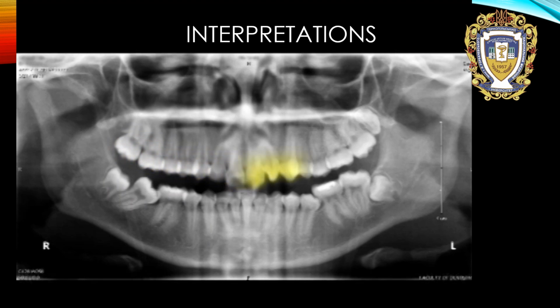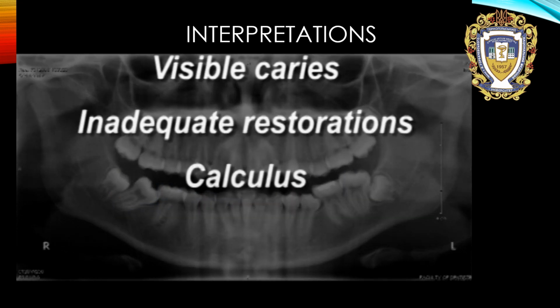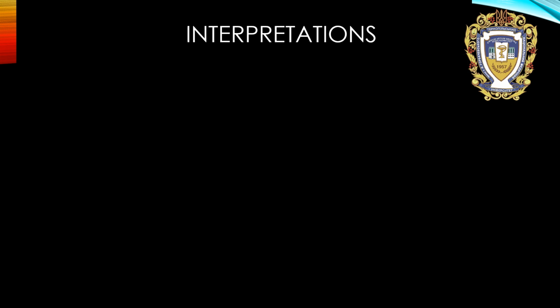Features related to teeth that must be reported are discussed in more detail in other resources. However, be reminded to identify any visible caries, inadequate restorations, calculus, and any eruptive, developmental, and acquired abnormalities.